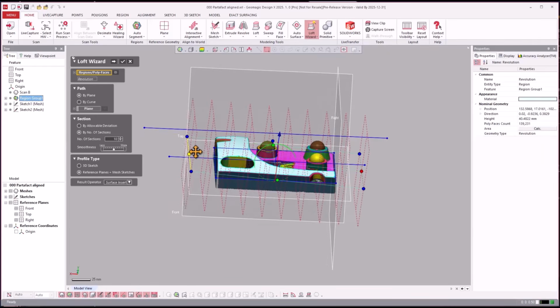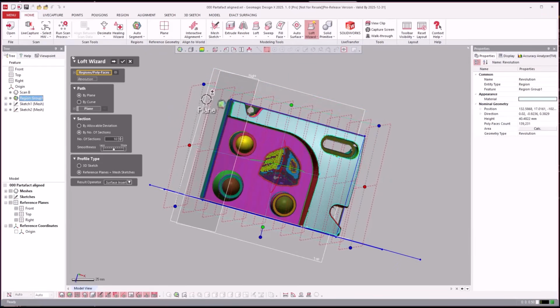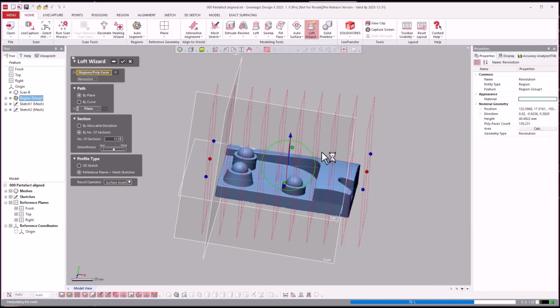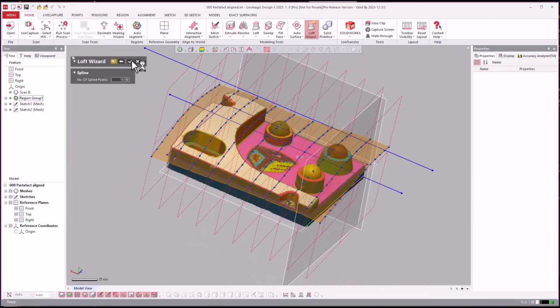So you can come in here and click on that, and you can see I can resize. And I am not doing a good job today here. So I'm going to hit next. I'm going to say surface insert with 2D sketches. Next. Next. There we go. We got next coming for us. And we will calculate that surface. It gives us a preview as normal. And then I can just say like 15 nodes. Hit OK.